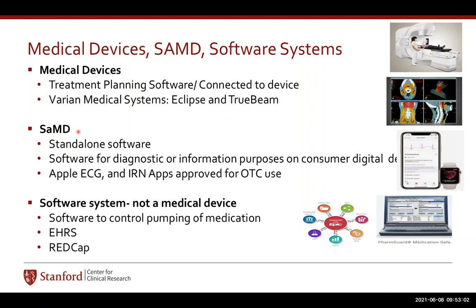Now let's go to software as a medical device. It is standalone software. Again, I had the opportunity in 2018 to work with Apple on the AFib and IRN application that is now approved by FDA for over-the-counter use. Many of you may already be aware of that, maybe wearing the Apple Watch also. So that is one example. There are many more. Now, software systems, we all know: REDCap, electronic health record systems, software to control pumping of medication. These are software systems. They are not a device.